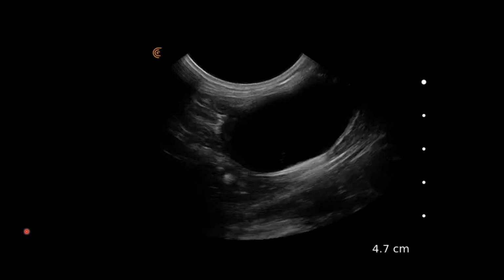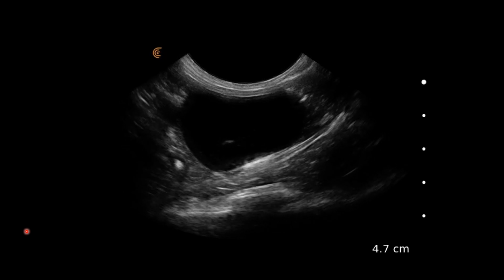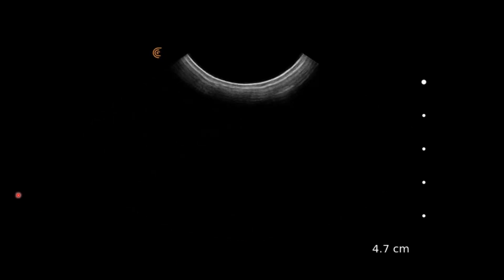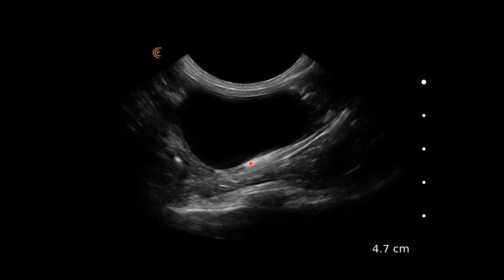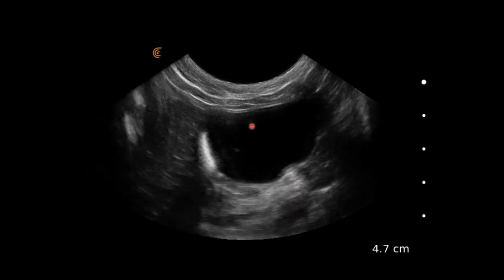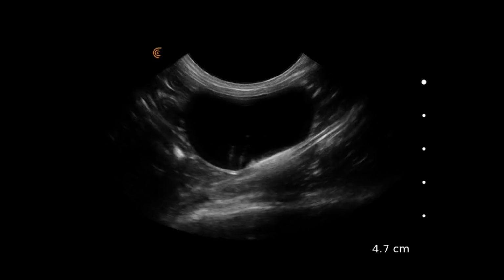So now we're giving the bladder a bit of a shake, ballottement, to help move this sediment and see whether we've actually got uroliths or whether it's all sediment, and we can see it floating around. So I'm just removing the probe to get that sediment to move, and then I can see with this gravity dependent view, where I'm looking down through the bladder towards the table, that the sediment is all moving around within the bladder.